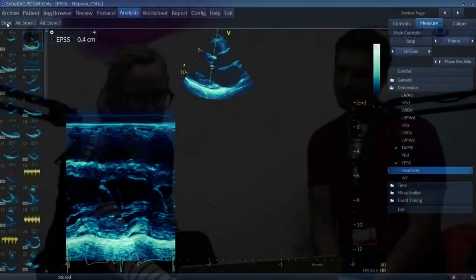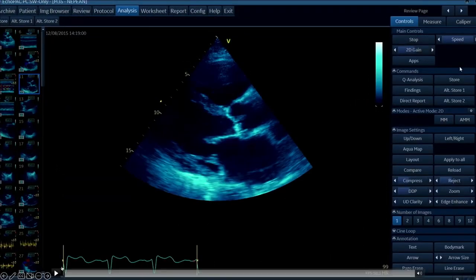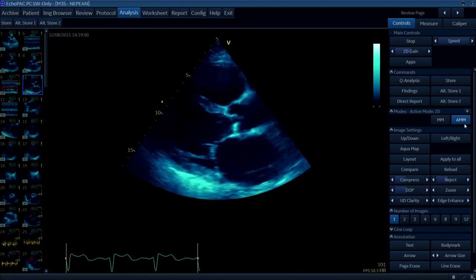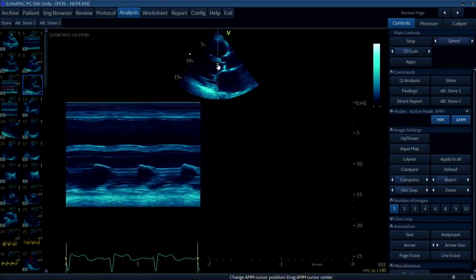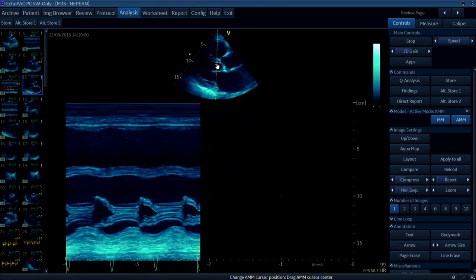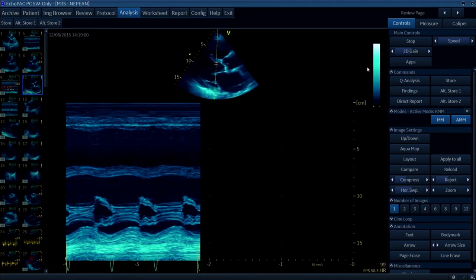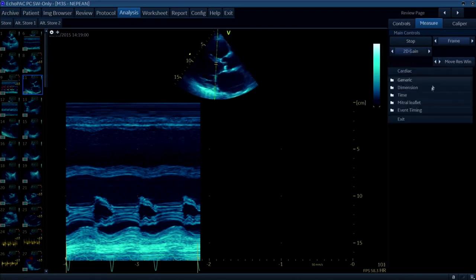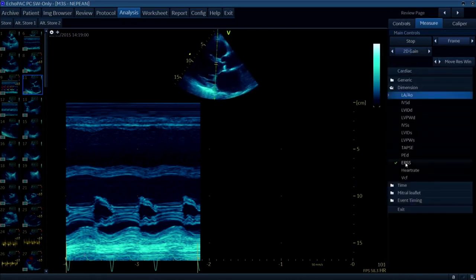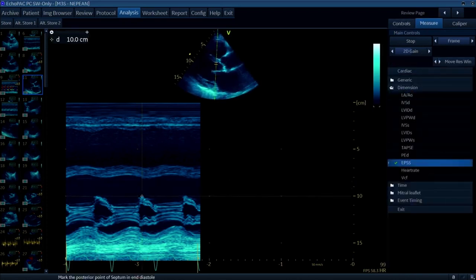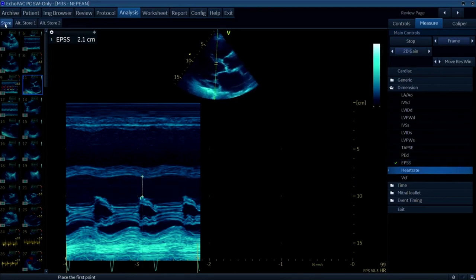We have a patient here that clearly has a reduced ejection fraction. We've put the M-mode cursor down at the tips of the mitral leaflet - it's not perfect because it's not perpendicular, as it's hard to do that. But you can see it's crazily above six millimetres, and that kind of goes with our eyeball assessment. Which is quite nice.